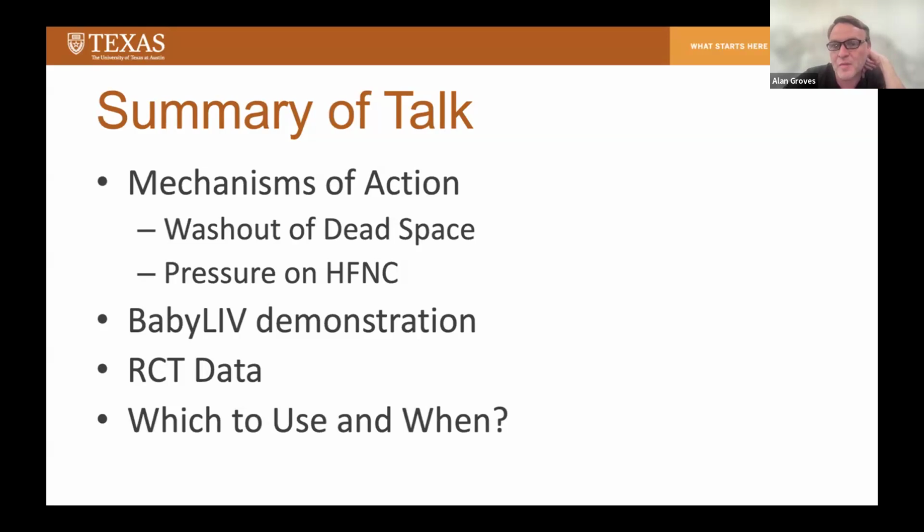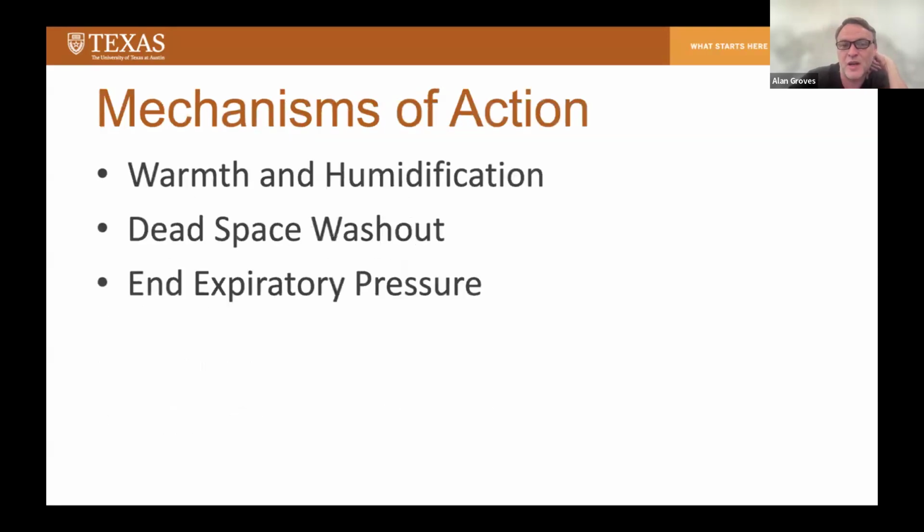We'll talk a little bit about the randomized controlled trial data, especially the Hipster and Hunter trials comparing high flow to CPAP, and then we'll do a very brief and very simple summary on which to use and when, bearing in mind the issues with the dead space and the pressure generation.